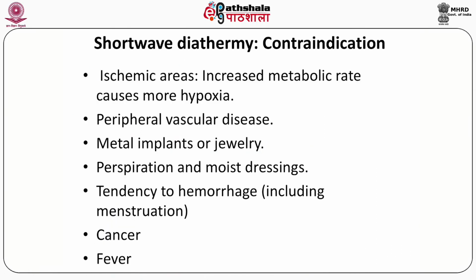After talking about the indications where we can use shortwave diathermy, we must know the contraindications of shortwave diathermy. Contraindications means those conditions in which we cannot use this technique. So in the following conditions we cannot use shortwave diathermy.